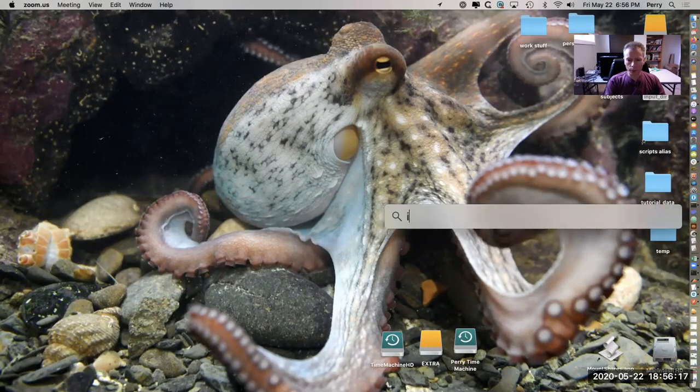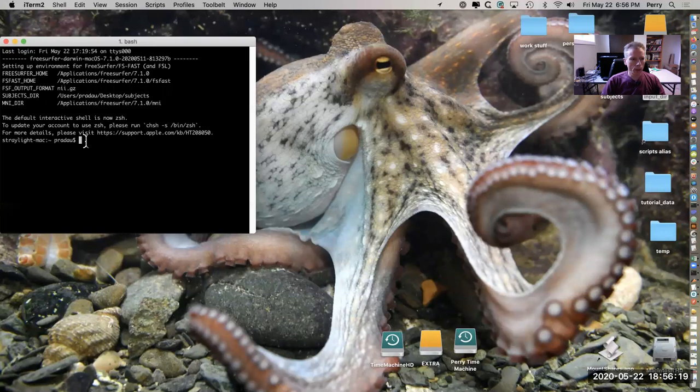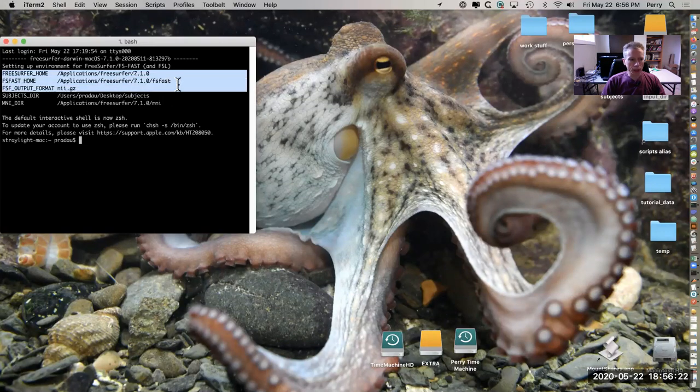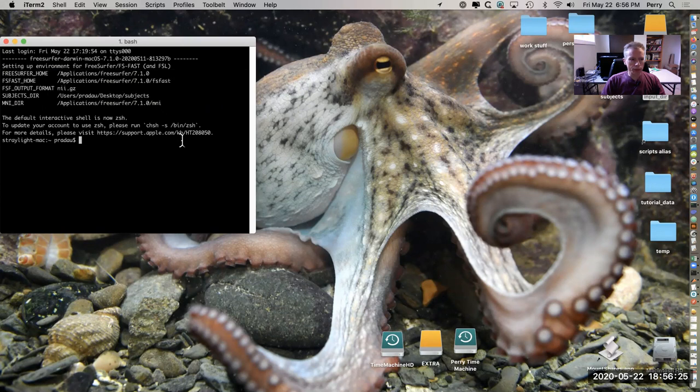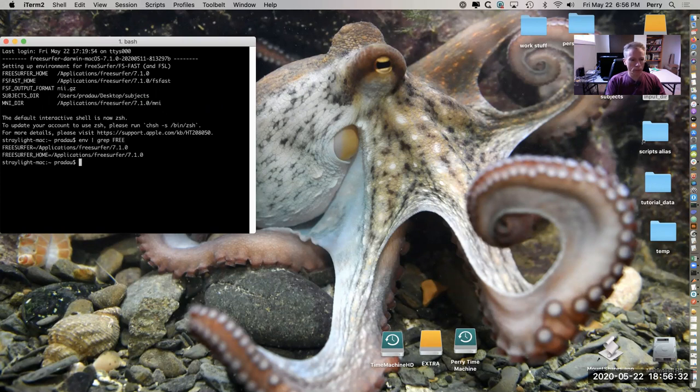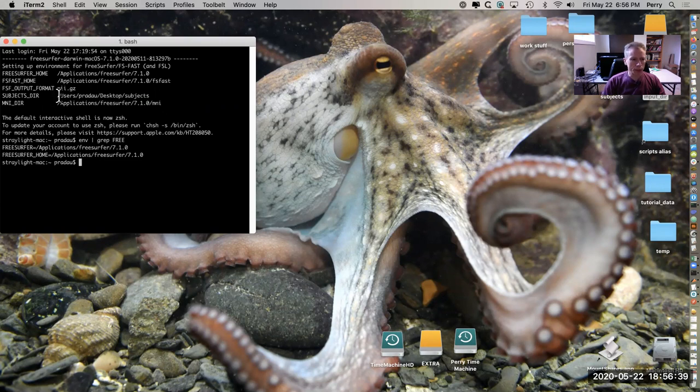So we can open up a terminal and we have bash profile set up so that we have these variables in our environment. For example, notice that in my case I've set up the subjects directory to be on the desktop, not in the applications directory.